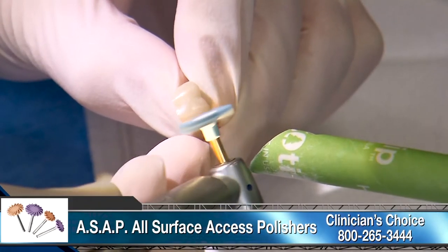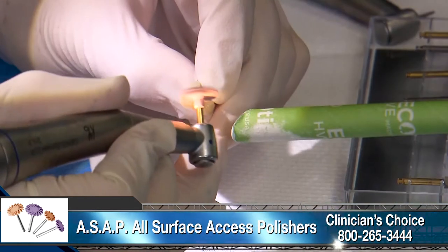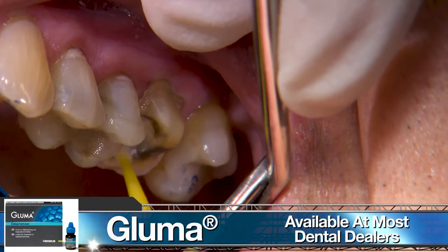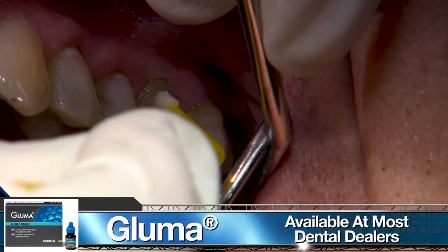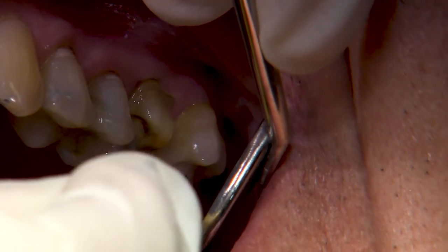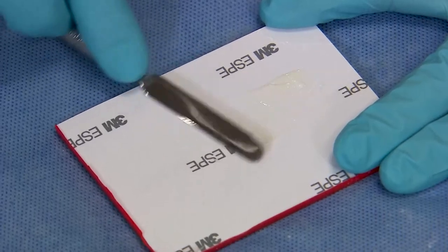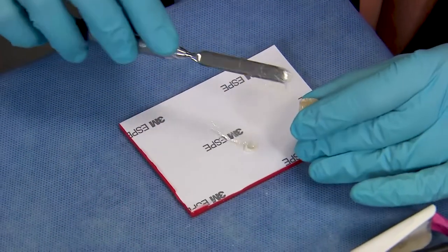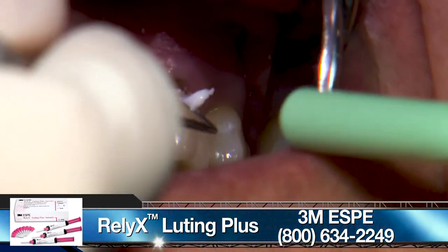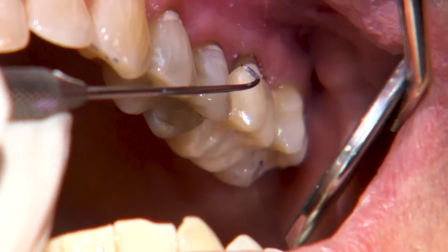Here I'm using the ASAP polishing kit by Clinician's Choice, which is designed to work really well on any restorative material. Prior to delivering the crown, I scrub a thin layer of Gluma desensitizer on the prep and allow it to sit for at least a minute. The solution will help disinfect the tooth and reduce the chances of post-operative sensitivity. Any conventional cement or resin cement of your choice may be used with this Bruxer Now material. For this delivery, we're using 3M's resin-modified glass ionomer Relyx Luting Plus. It's very easy to use with a pretty quick cleanup.